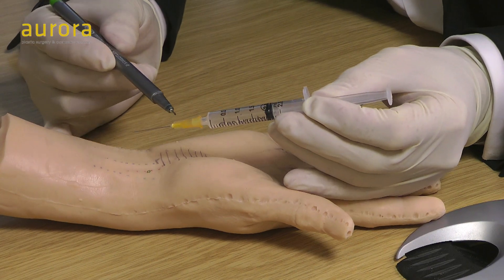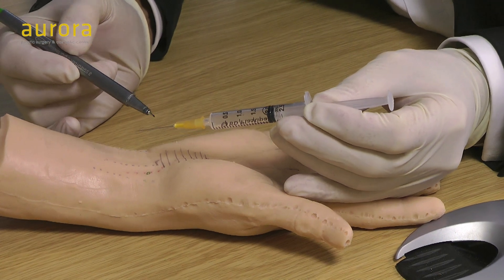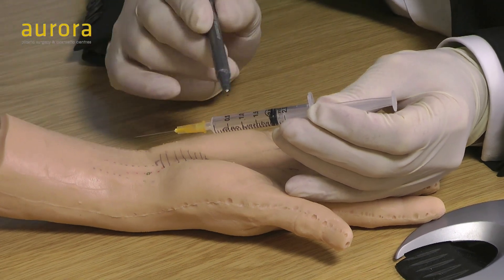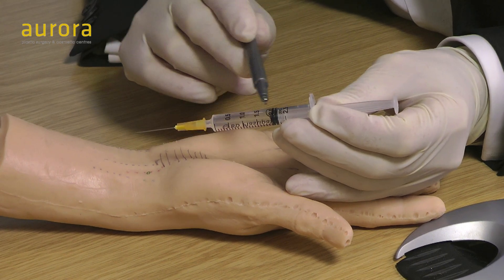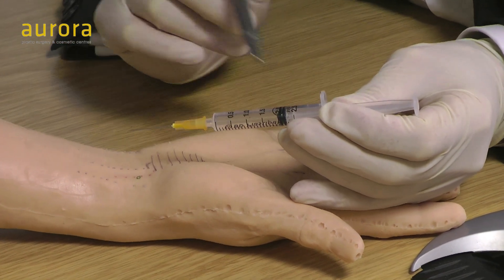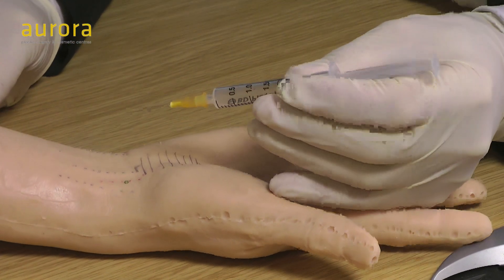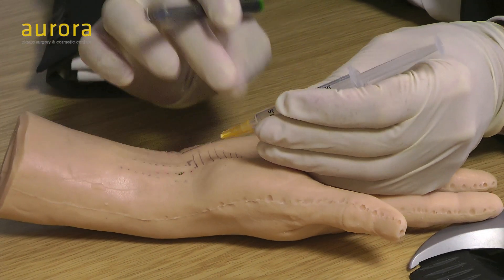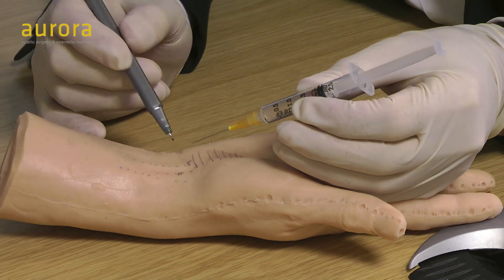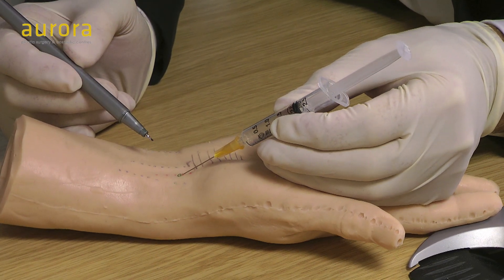I always like to use the orange needle because the smaller the needle, the less painful and less traumatic it is for the patient. I've got two mils in there: one mil of local anaesthetic lignocaine and one mil of triamcinolone 10 milligrams per mil. It doesn't really matter what steroid you use — use whatever's familiar to you. Bevel of the needle up, numbers on the syringe towards you, gloves on, sterile skin — and we're all ready to go.